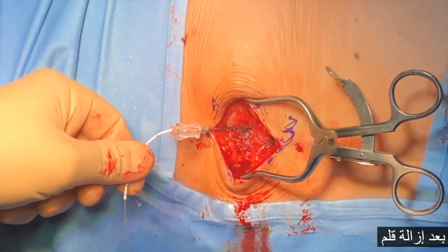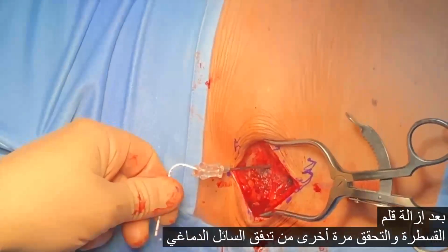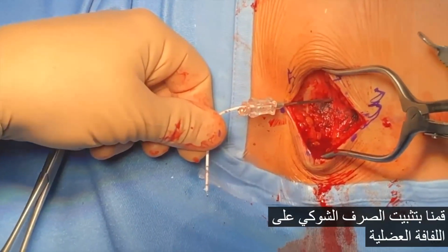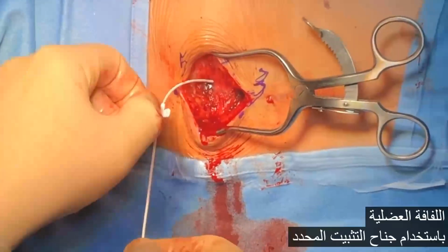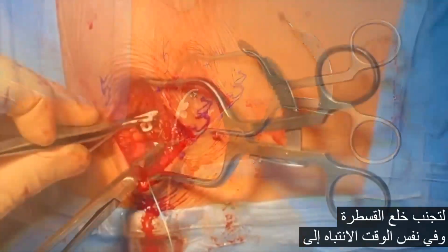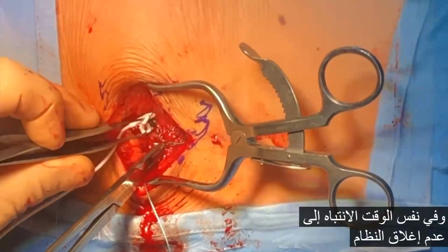After removing the stylet of the catheter and checking again the outflow of the CSF, we anchor the spinal drainage to the muscular fascia using the specific fixation wing in order to avoid catheter dislocation and at the same time paying attention not to close the system.